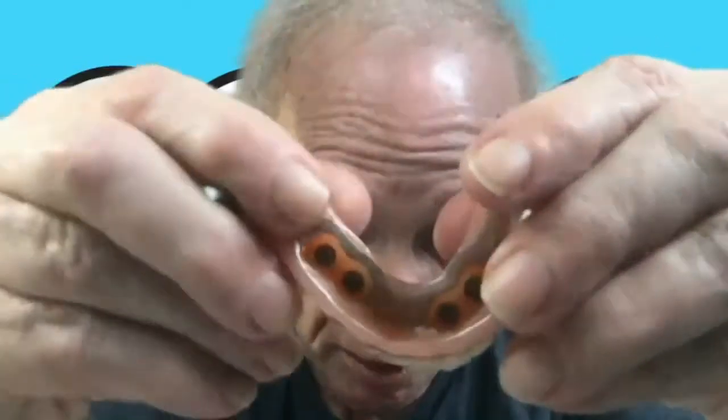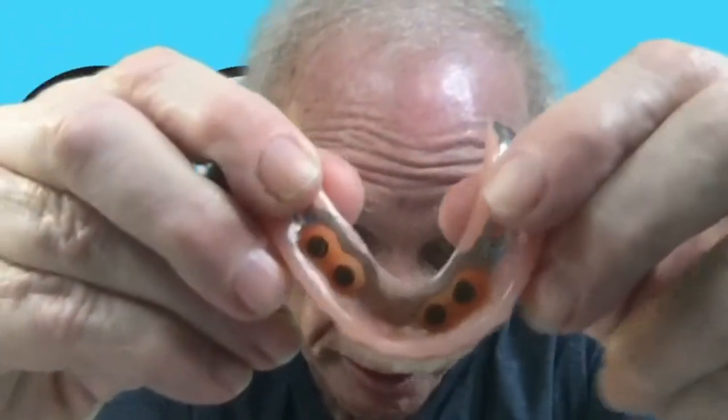So this implant has a screw abutment, right? This part is the implant, right? There's threads, it went onto a drill, it got drilled into the bone, and after a few months it took, and then this was screwed in. And at the top of this is this little ball. And the ball, when this was working, went in.